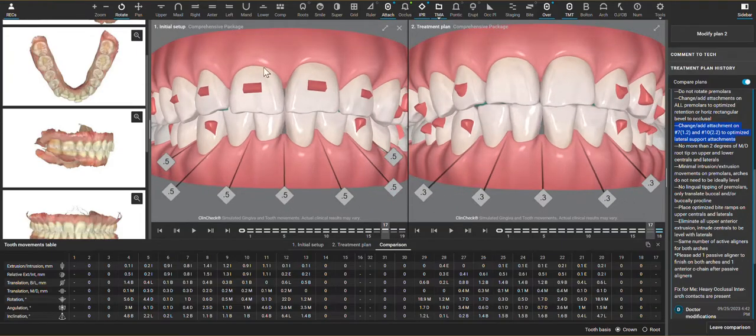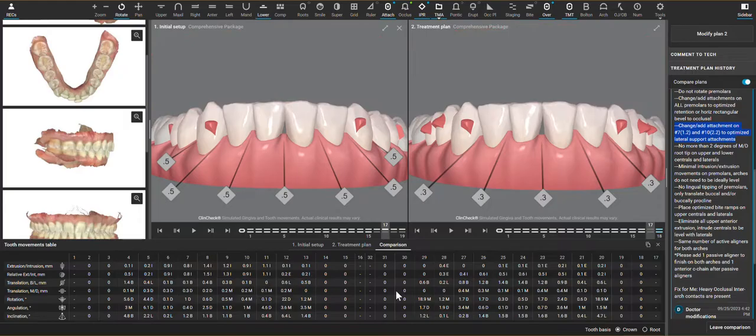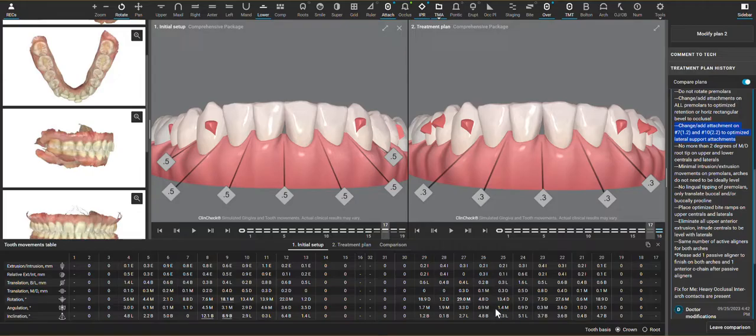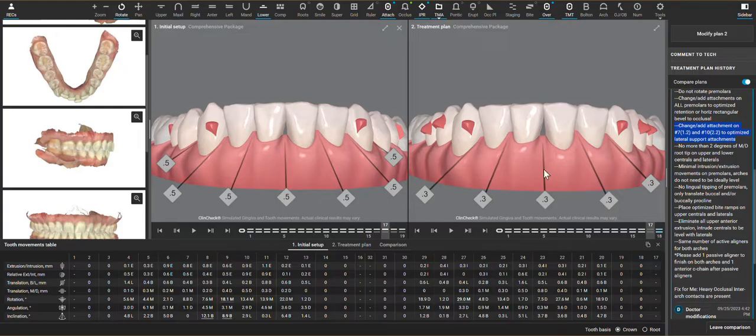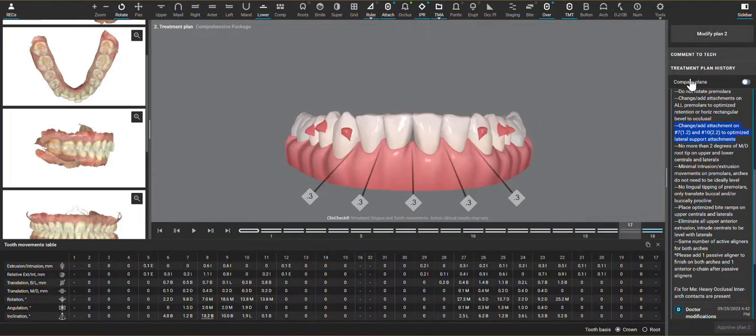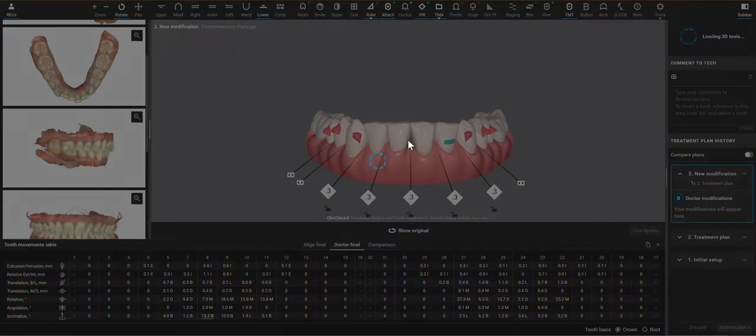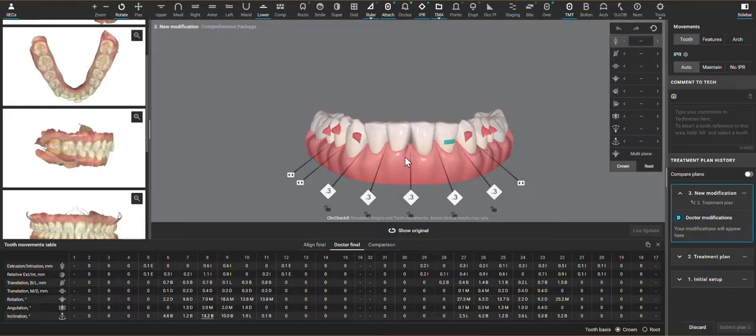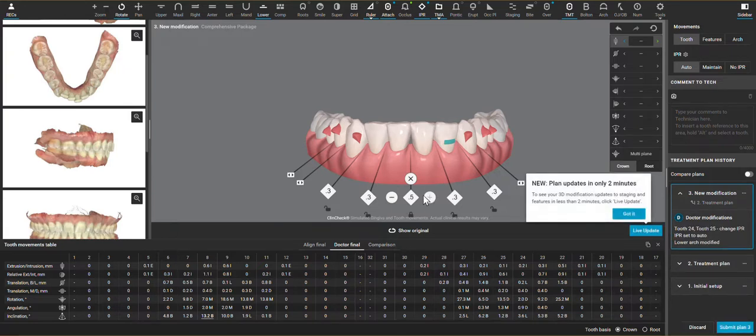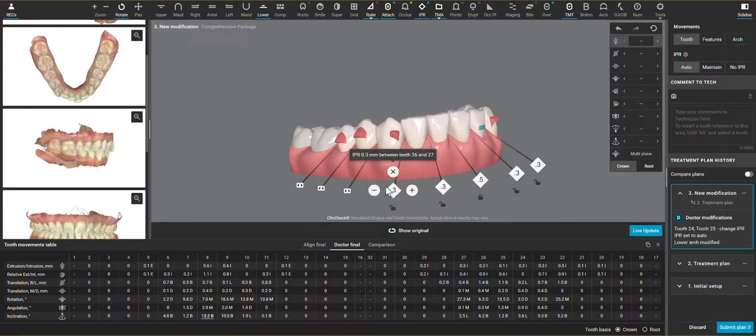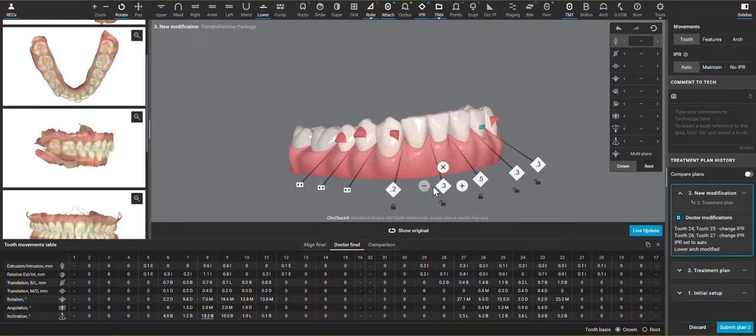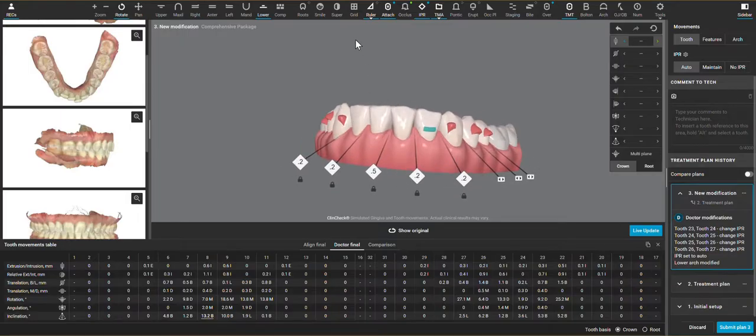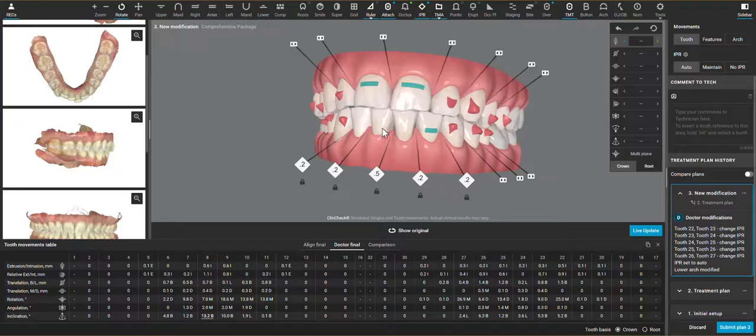But that same angulation gets planned quite a bit on the lower incisors as well. I don't see it in a large dimension here, but eliminating that can sometimes bring up larger black triangles, and that's where one of the final changes that I will make is to redistribute where this IPR is being planned by just increasing it between the centrals, and then we don't need to do as big of IPR on the adjacent teeth.